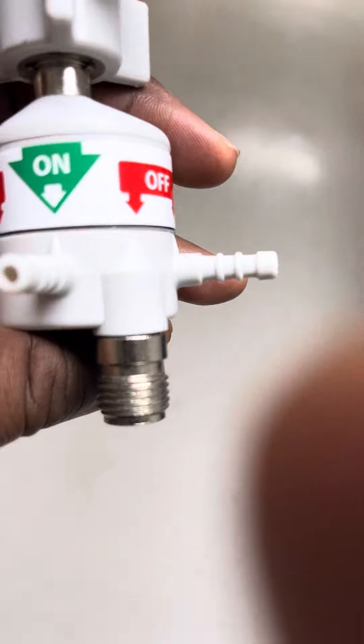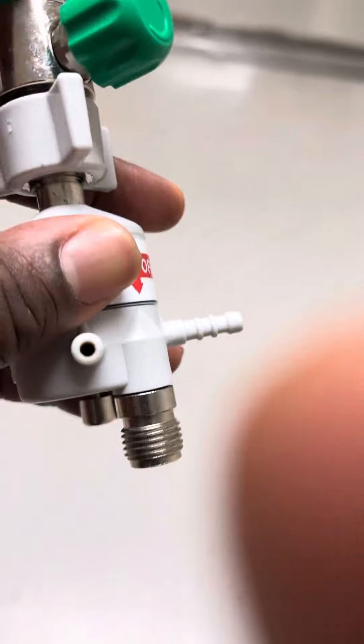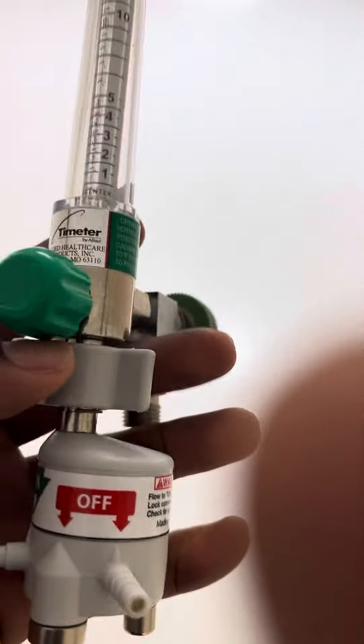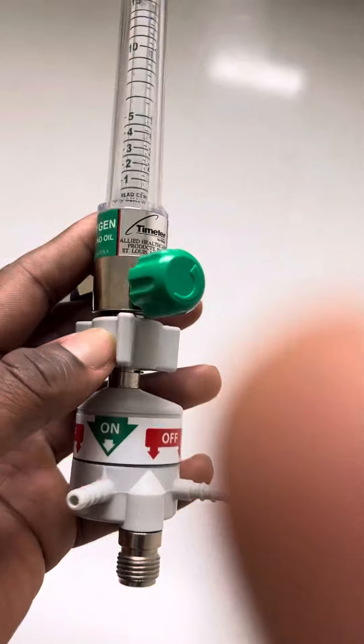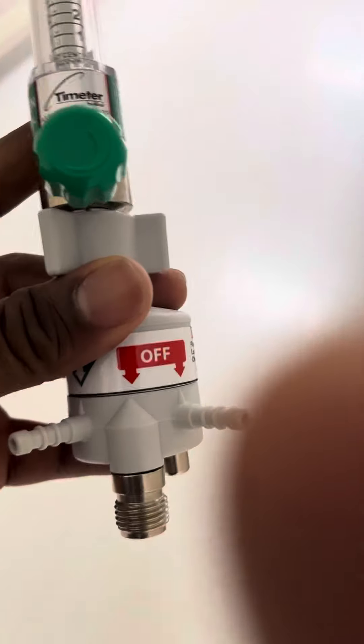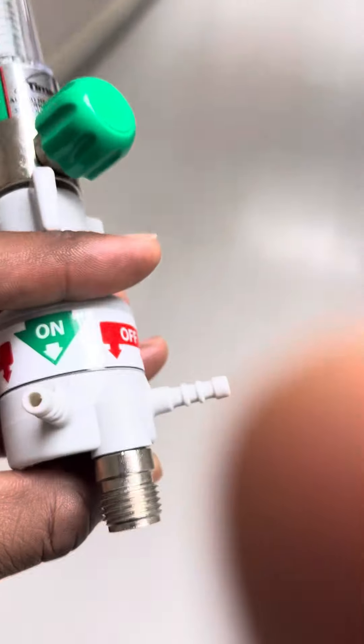Usually up to six liters, or we can connect our — sometimes we call them simple high flows. They go up to 15 liters with bubblers and the specialty cannula, which allows us to have more flexibility in our oxygen administration needs with this particular flow meter.